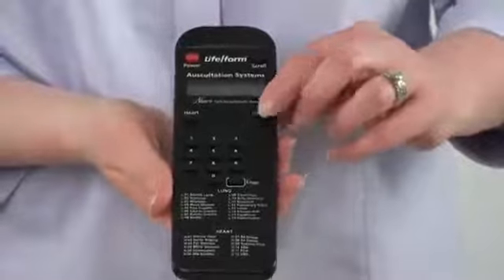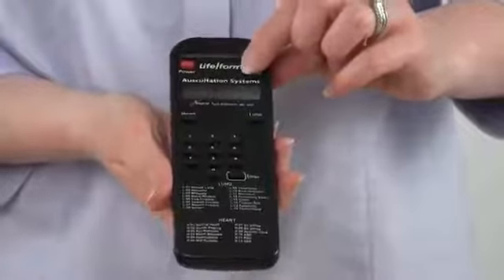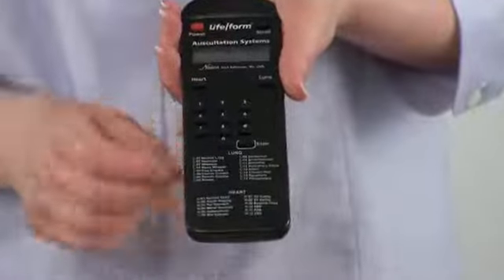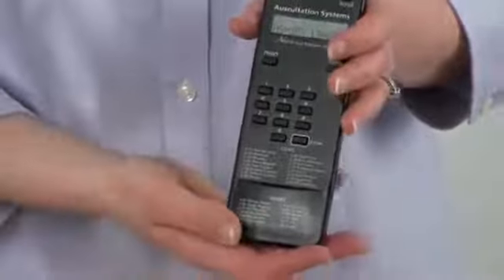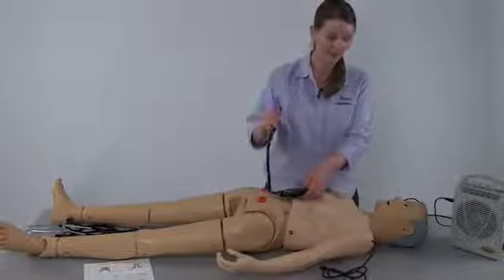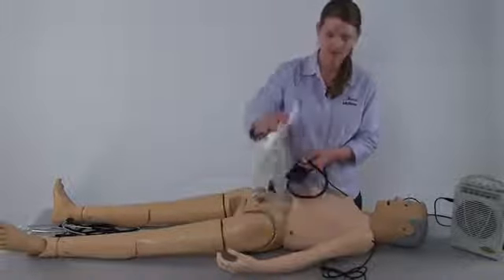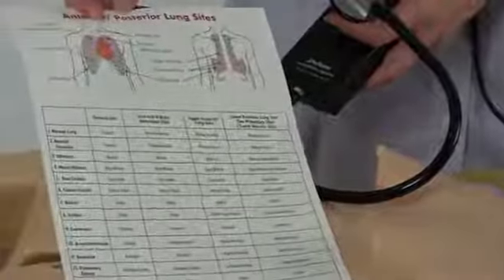Pressing the lung button will bring up the lung functions on the screen. Again, you can use the scroll button to scroll through the different lung sounds, or use the numbers on the remote to select the lung sounds you wish. Pressing enter will allow your selection to be displayed on the home screen. Once you've determined which heart and lung sounds you wish to hear, you can pick up the smart scope and place it on the appropriate spaces on the mannequin. Included with the mannequin are helpful graphs that will allow you to determine where the sensors are for the pertinent heart sites and anterior and posterior lung sites.